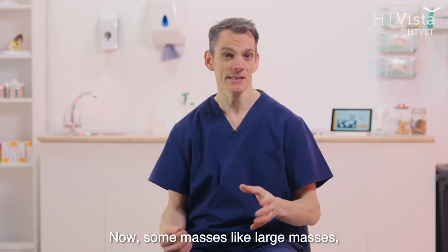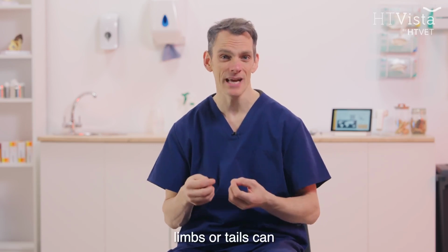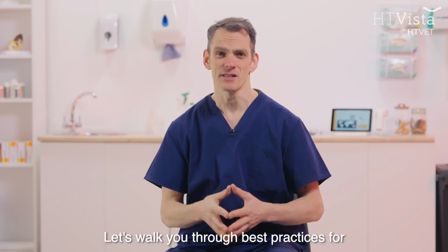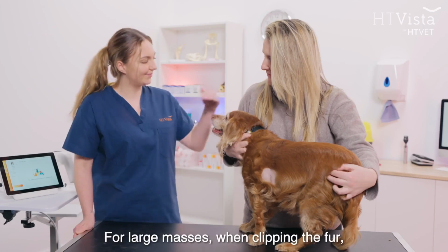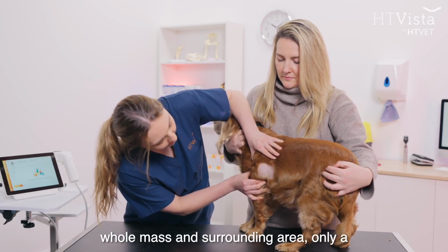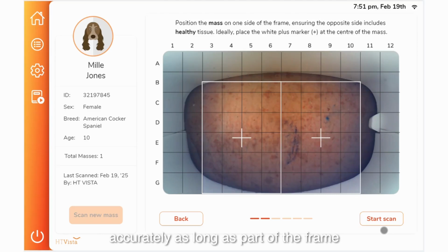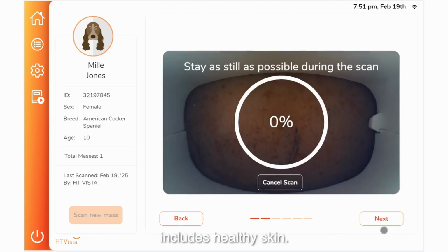Now, some masses, like large masses, subcutaneous masses, or those located on limbs or tails, can present unique challenges. Let's walk you through best practices for handling these cases. For large masses, when clipping the fur, you don't necessarily need to clip the whole mass and surrounding area, only a patch the size of the scanner. It's best if half the frame contains a mass area and the other half the adjacent healthy area. Large masses can still be scanned accurately as long as part of the frame includes healthy skin.